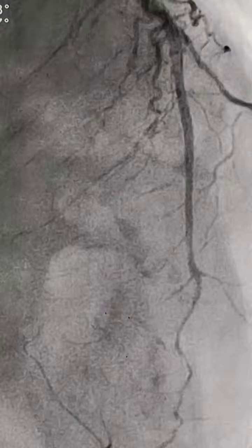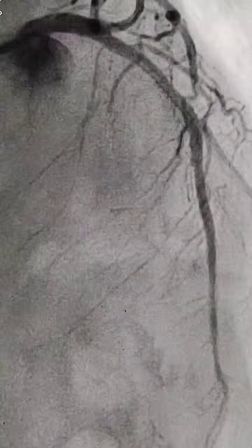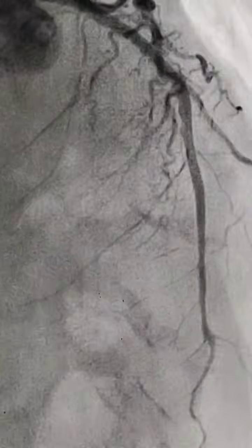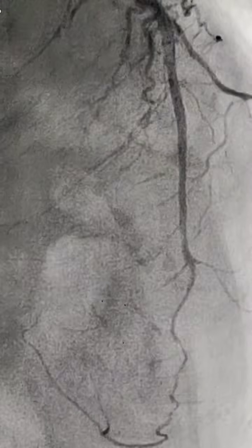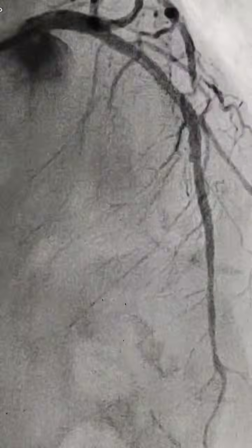And I felt there was some under deployment of the stent, under expansion. So I did the NC with the 3.5. And this is the picture after NC. You can see how long the LAD is, a wraparound LAD, which is supplying a large portion of the heart. So this was the angioplasty to the LAD after 5 days. The patient was stable.